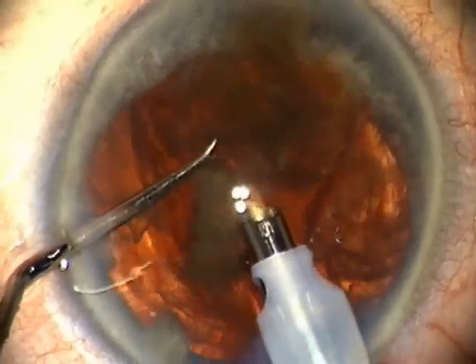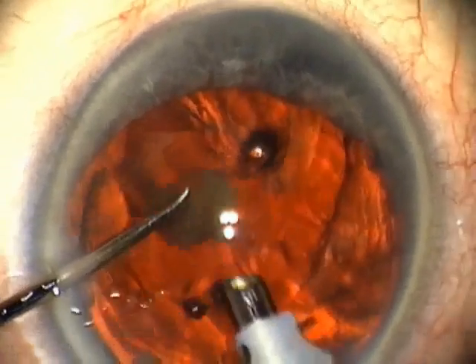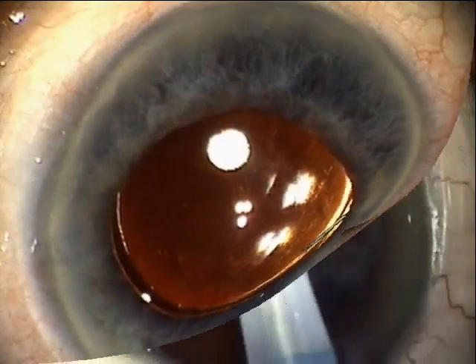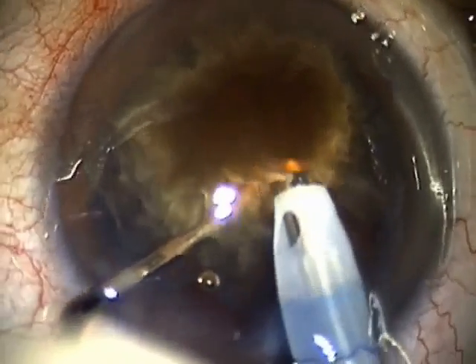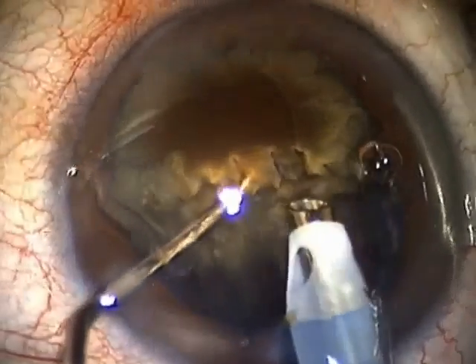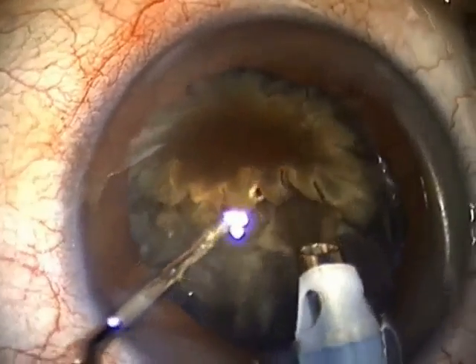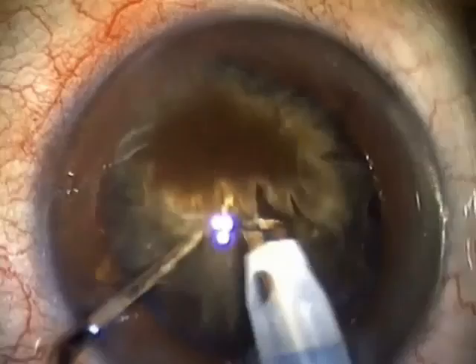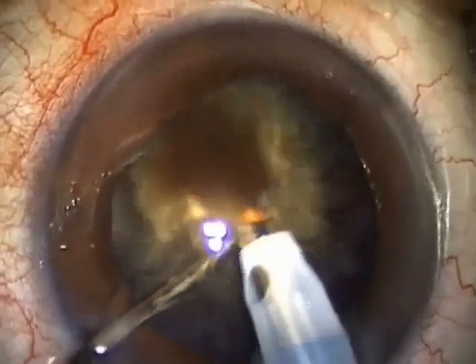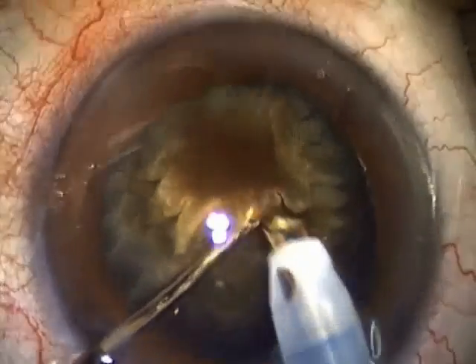Here we're down to this very small plate — low power. You want to keep the material close to the tip; don't want it to shoot away from the tip. Low power keeps the material as close to the tip as possible. The use of Viscote really protects these corneas — they do quite well. This is another extremely dense lens, just to demonstrate the power of the Stellaris unit. It's really good to look at the incision throughout each of these cases — you'll see there's never even a hint of a wound burn, and we are definitely dealing with the most dense lenses most of us will ever have to handle.